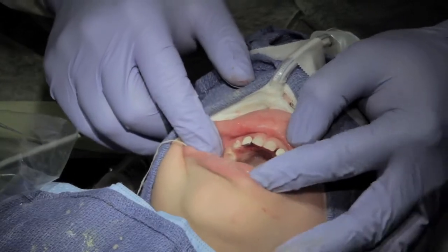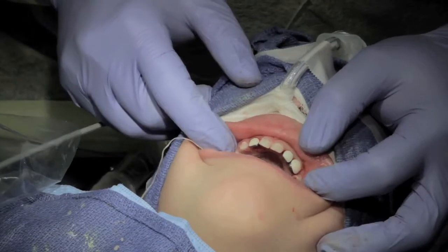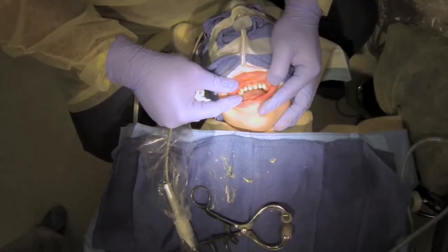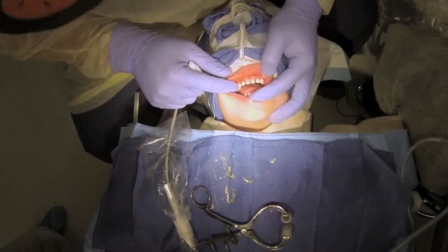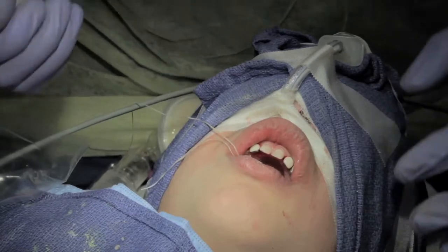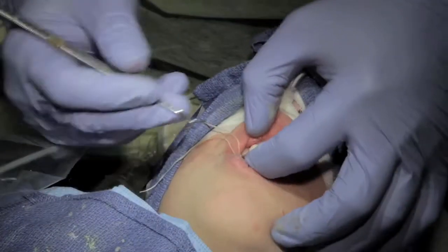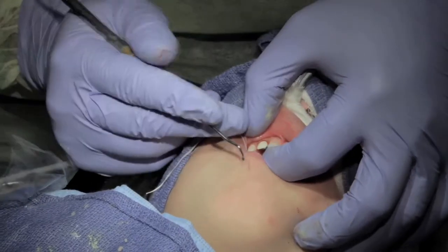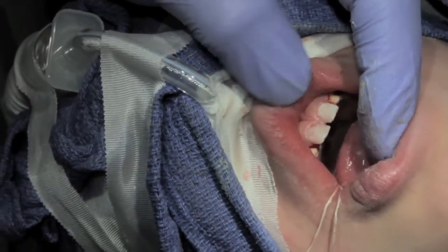So we can cement those. That's how you do two lateral incisors and one canine — turns out pretty good. Extremely stable and durable. In my opinion, one of the nicest restorations you can do. So what we'll do is cement these.